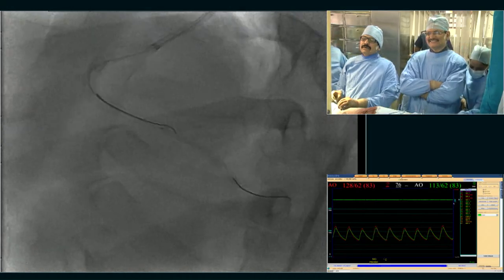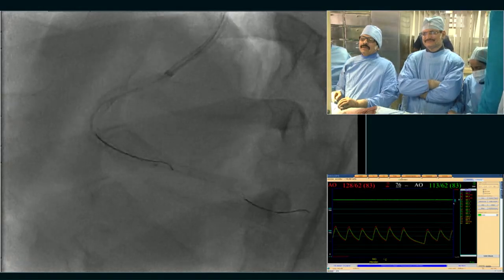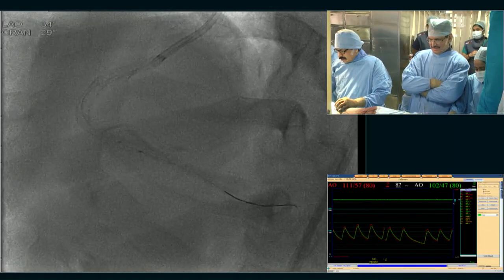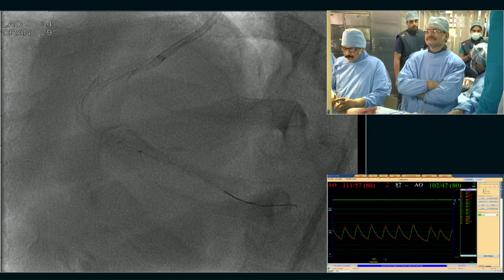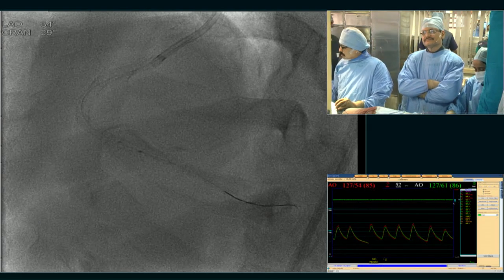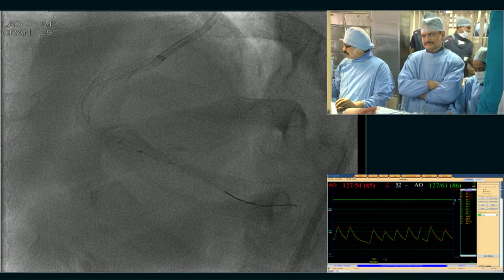So how long did you try with this wire? I will try switching to the Whisper wire. You feel such type of two layers of wire strands to cross. Regarding the ideal wire, is it Ultimate Bros or Fielder XT?